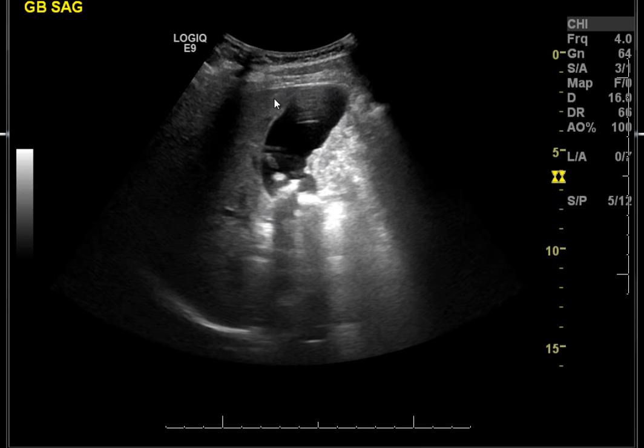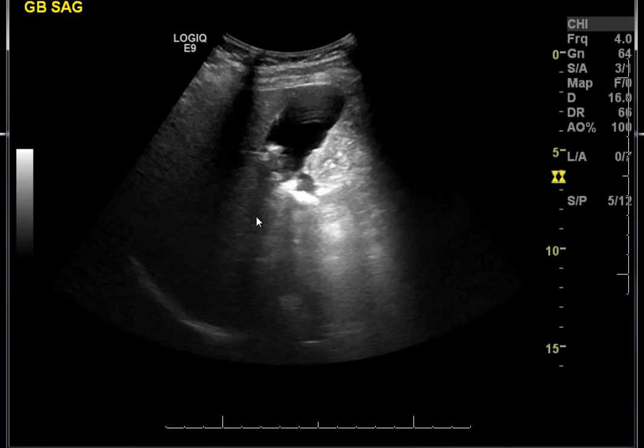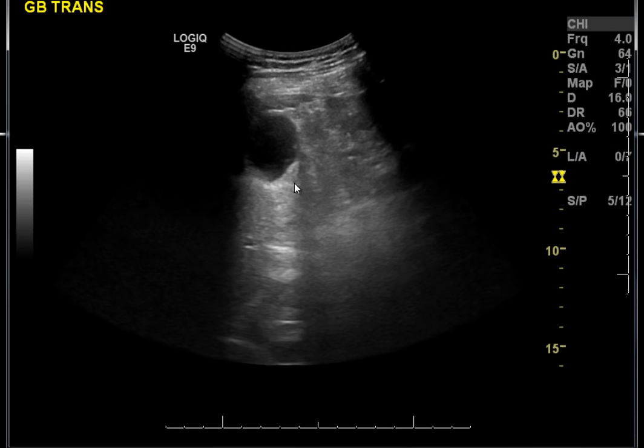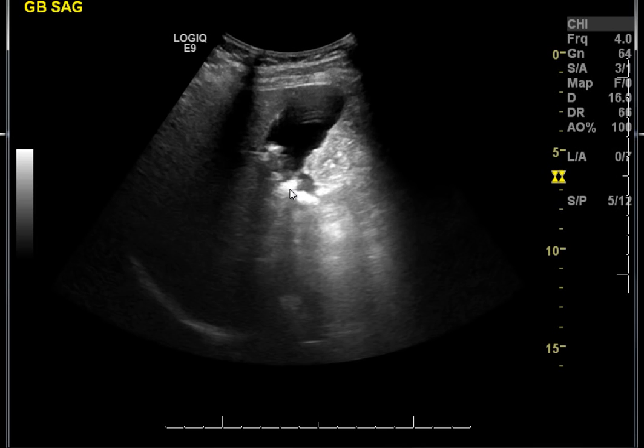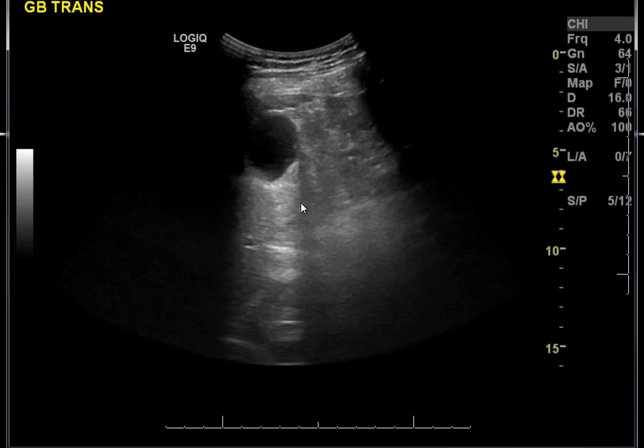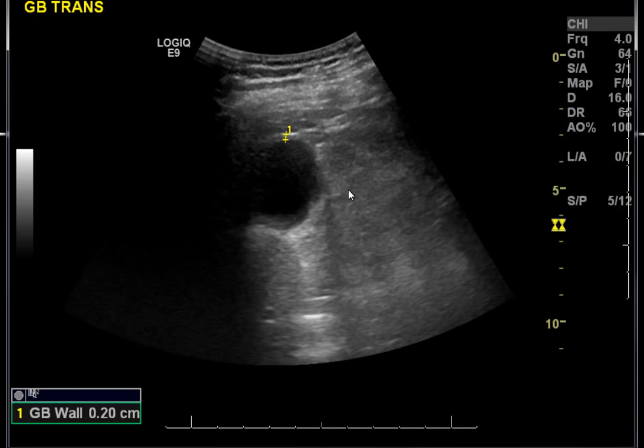Okay, so now on this case, we see that the gallbladder, which we see the walls very nicely here, has some highly echogenic areas in the neck region that are causing a loss of transmission of sound. And this is what you would expect to see with gallstones. See, there are echogenic areas within the gallbladder that are causing the sound not to be transmitted. Why is that? Because sound travels by compressing and expanding tissues, and stones are inelastic, so you end up not transmitting.